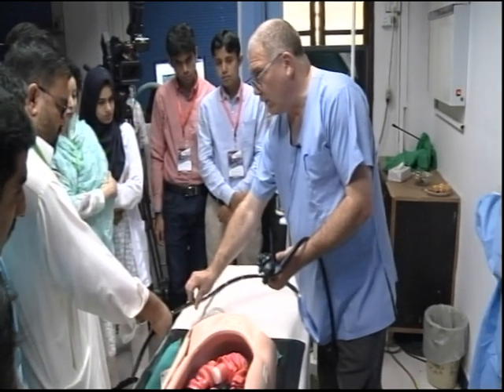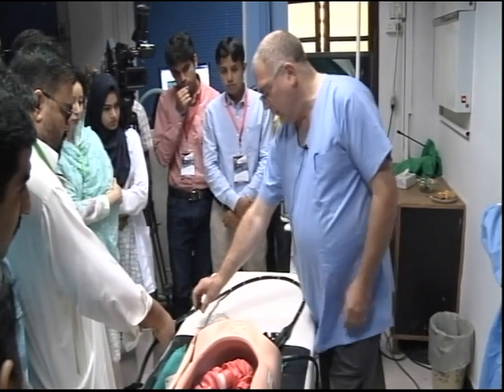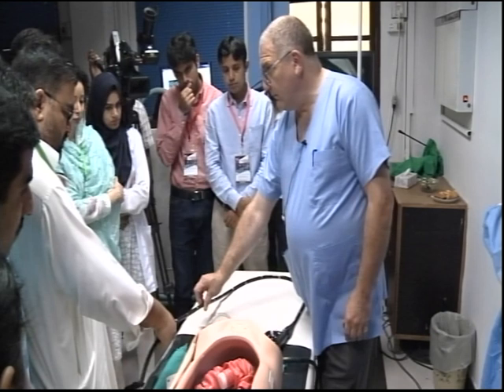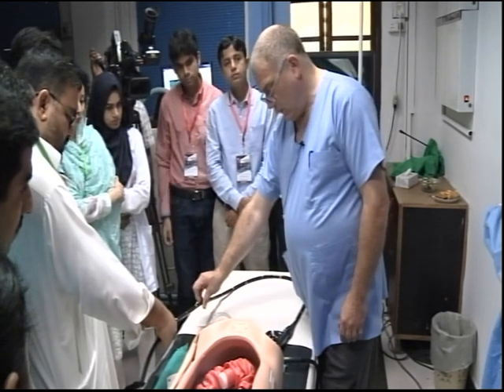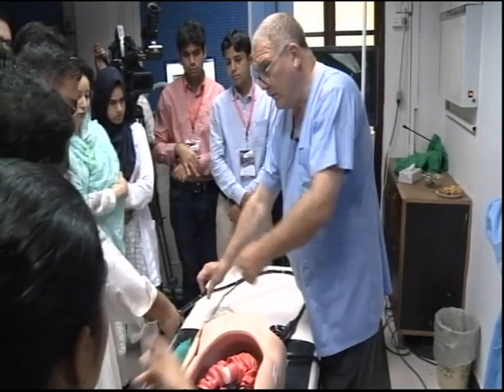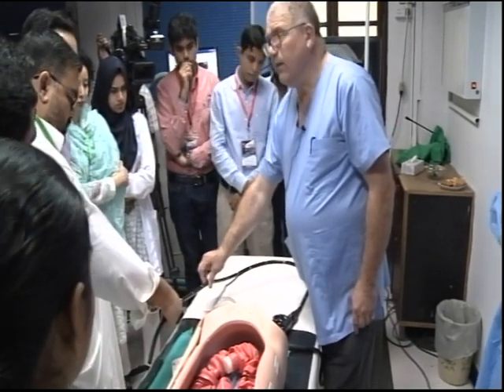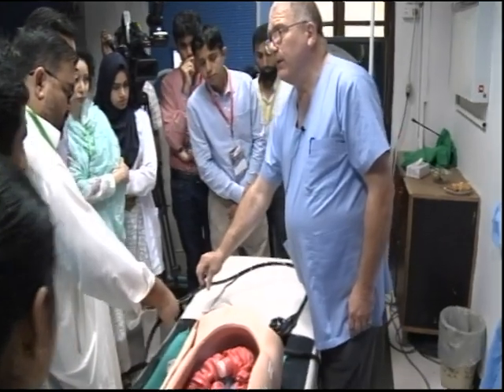I want to put clockwise torque on the scope. What is the scope doing? It's moving. Where? It's moving right. It's moving here? It's moving where else? Yeah. Head is moving. But what else is happening with the scope?